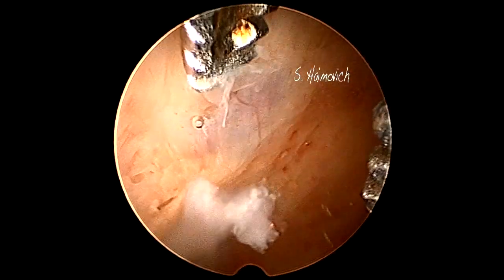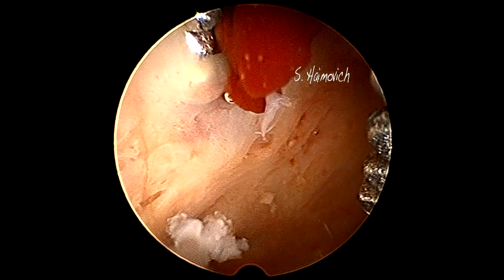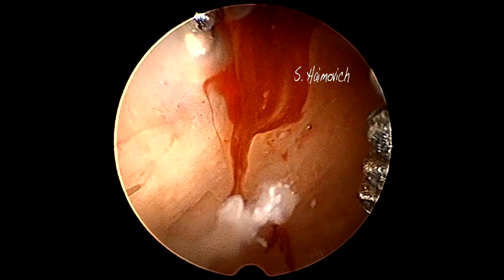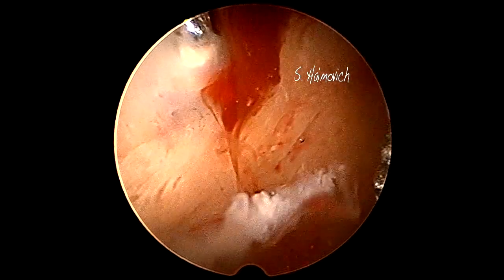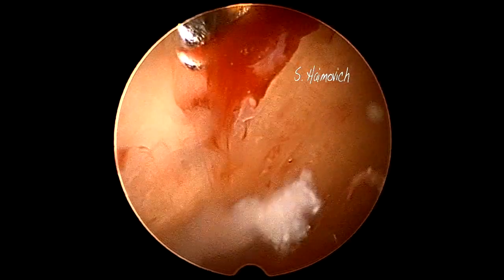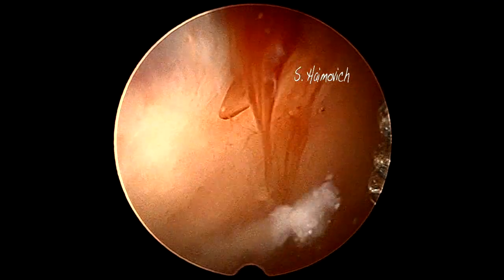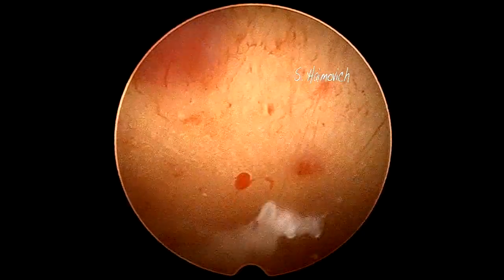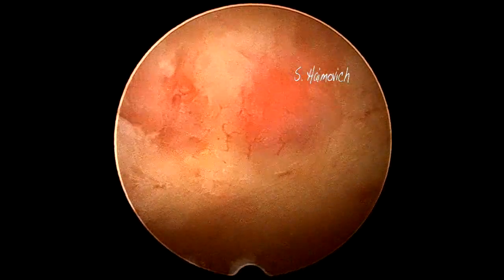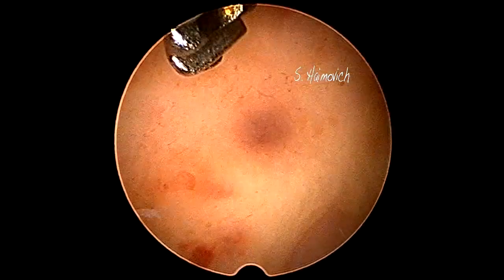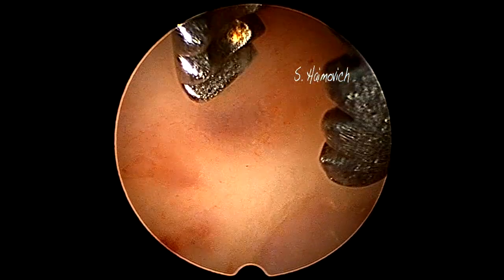When we open one of these dark spots with the grasper, a brownish, chocolate-like secretion comes out — it is old brown blood, responsible for abnormal uterine bleeding in some of the patients. Adenomyosis is the endometriosis of the uterine wall.